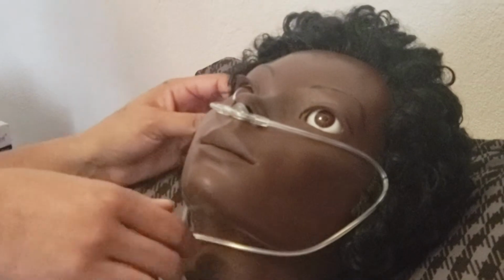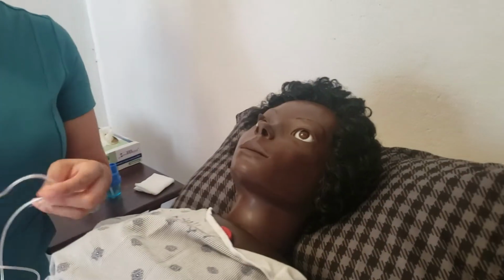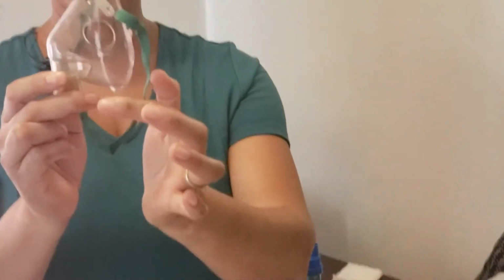There are other forms of oxygen administration, and we are going to talk next about the mask. So this is our mask. This is a pediatric mask. It's a little bit tiny. You are going to see that the mask has a hole on the side, on both sides. This hole is supposed to be there and is not supposed to be obstructed.